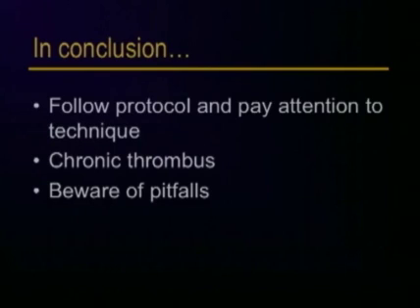So in conclusion, when performing these examinations, it's important to follow protocols as to not miss important findings. It's important to pay attention to technique so as to not have false positive examinations or false negative examinations. Also, it's not desirable to use the phrase chronic thrombus and imply that you have a treatable situation. Perhaps use the phrase chronic changes or scarring or sequelae of prior thrombosis when reading these examinations. And last, beware of pitfalls so as not to make a false diagnosis.